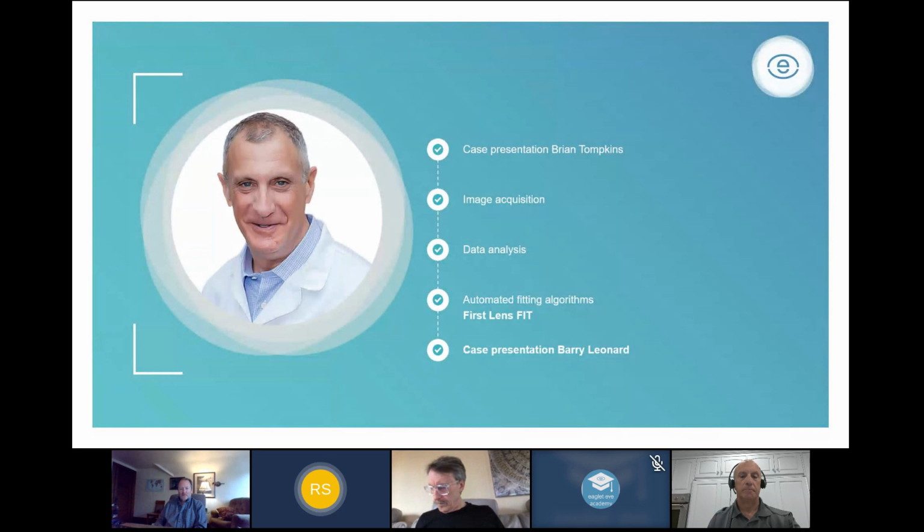Fred Gagnon asks, I understand that the software selects the appropriate sag according to the lens diameter. That's correct. But can you select a sag depending on the diameter of the lens you want to try? Well, yeah, you can plug in, you don't have to go to the calculator. You can plug in the chord length of any lens and it'll calculate the sag.